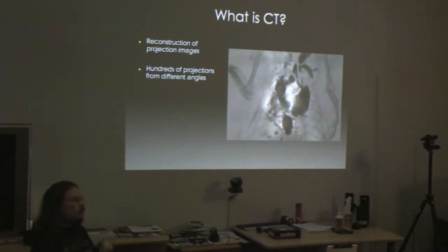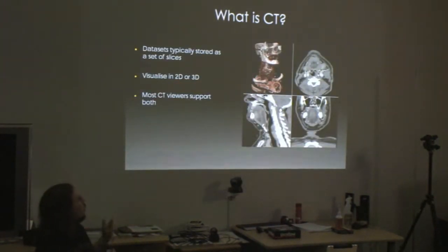And this is what CT does. It's been invented in the 1970s, and from then on, it developed into various subgroups of medical imaging. I'll be talking about spectral CT in this case, and I'll explain how that is different. But first, this is what CT slices would look like. So one data set comes off the scanner. It would look something like this.